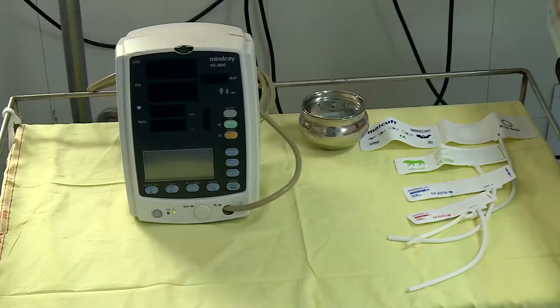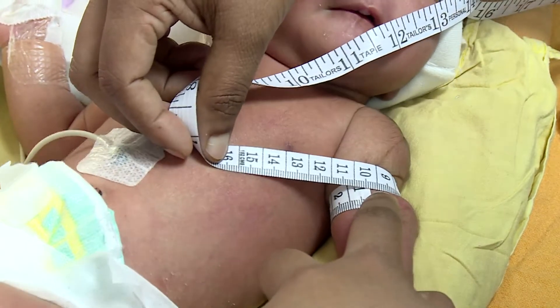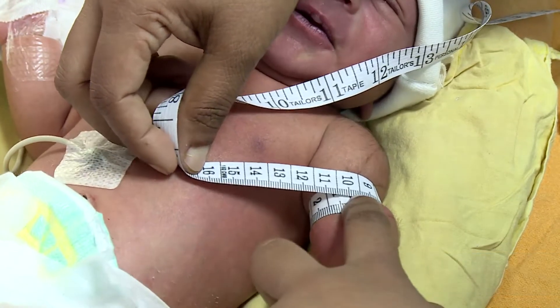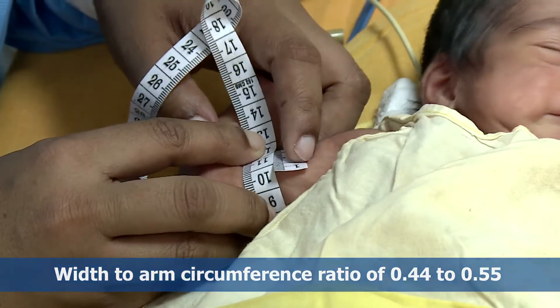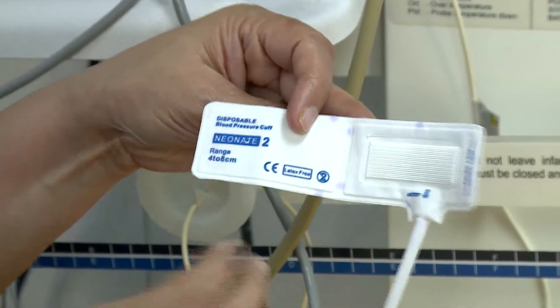The second step is appropriate cuff size. Measure the arm circumference and select the appropriate size cuff for the limb. The cuff bladder length should cover 75 to 80 percent of the arm circumference, and the width to arm circumference ratio should be 0.44 to 0.55. The table here depicts the cuff size applicable for a defined limb circumference.